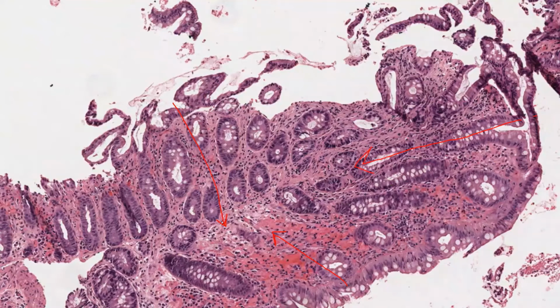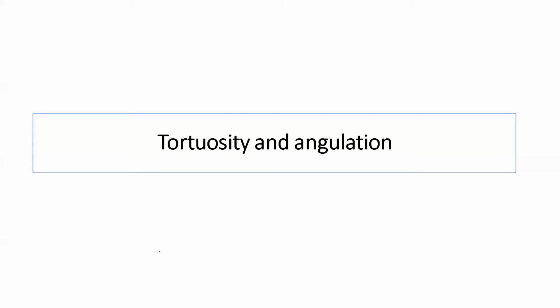So I cannot call this one horizontally aligned, because in relation to this surface, the crypt is actually vertically aligned and it is absolutely fine. Yes, this one is horizontally aligned for this other surface, so you are comparing it to the wrong surface. So make sure that you don't get caught in the middle of this. It's a simple thing, but when you are rushing, it is very easy to get into this.